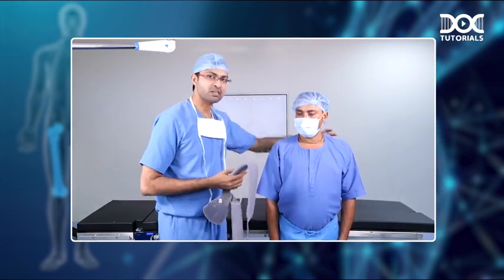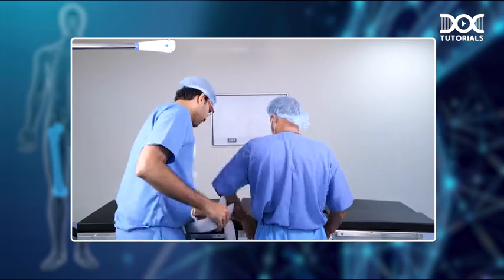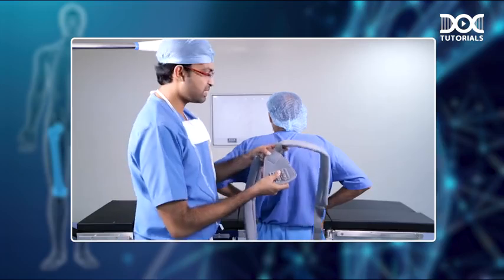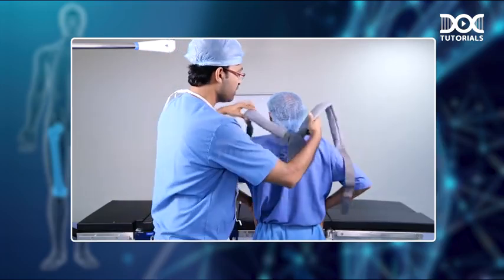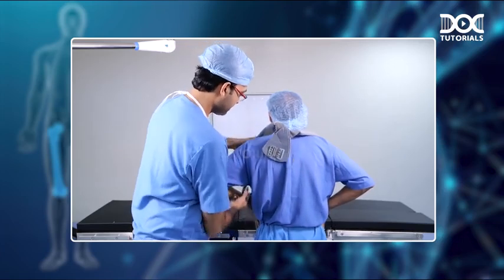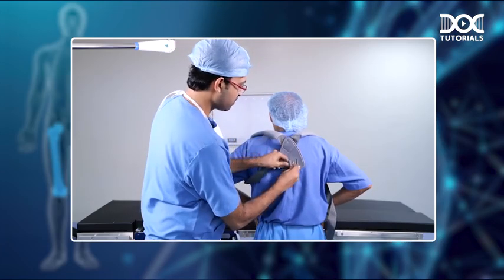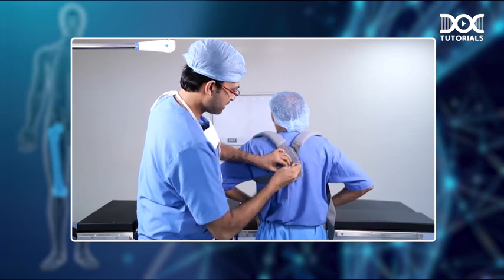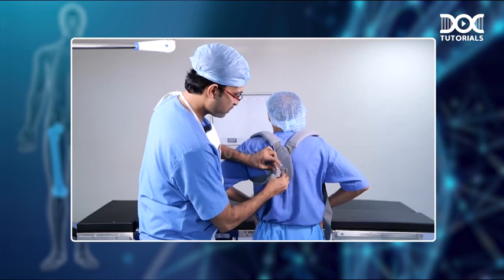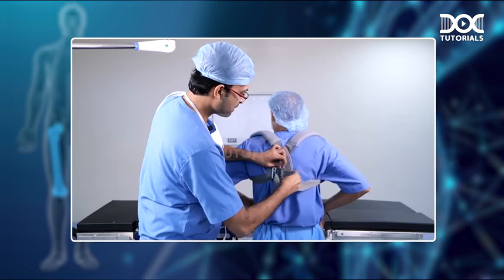You ask the patient to turn around. Then you ask the patient to keep the arms on the hip like this. Now this part goes posteriorly like this. Then you take these two straps, wind it around the shoulder and the axilla like this. You have places to put this inside like this, and you have a spike lock here which can be used to lock it in place. So you can use the same method on the opposite side as well.